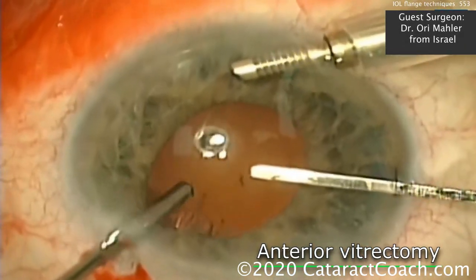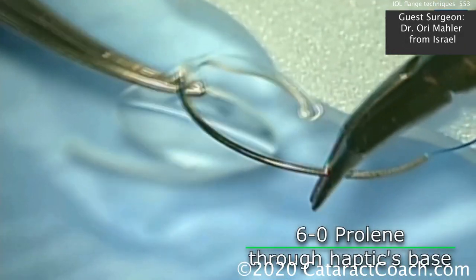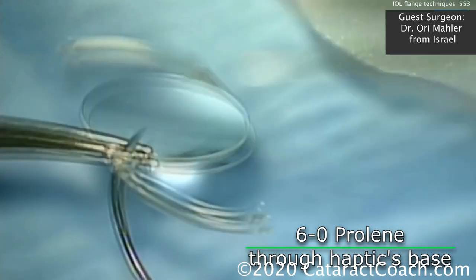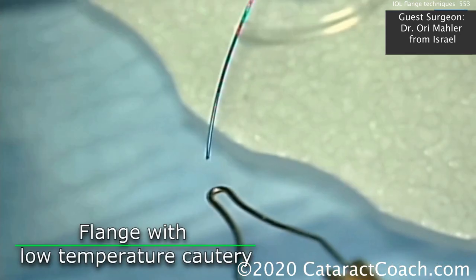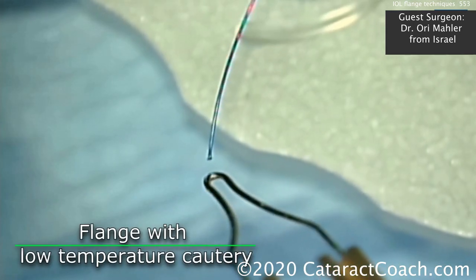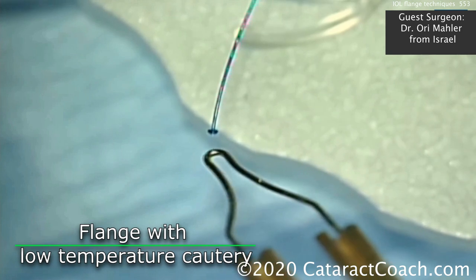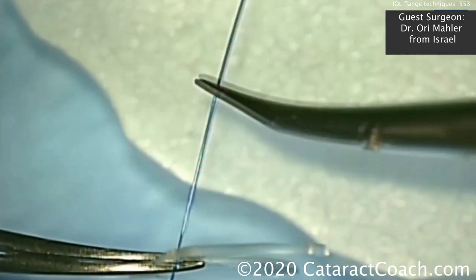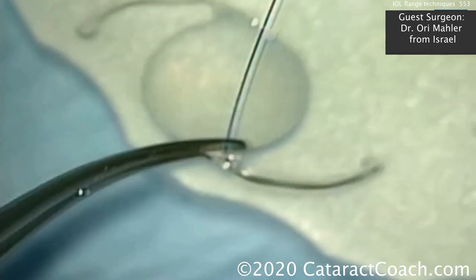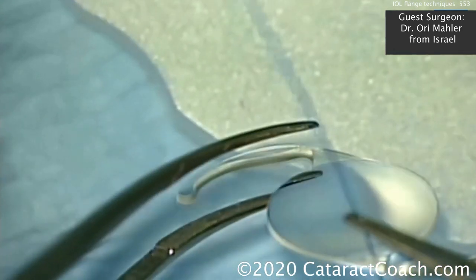Let's look at another case: antervitrectomy, no capsular support — a double flange. First, using a 6-0 prolene and using the suture itself to push it through the haptic-optic junction. Then apply a little bit of cautery on the 6-0 prolene suture, creating a nice strong flange. Pull that through and you can see it's going to stop just right there.